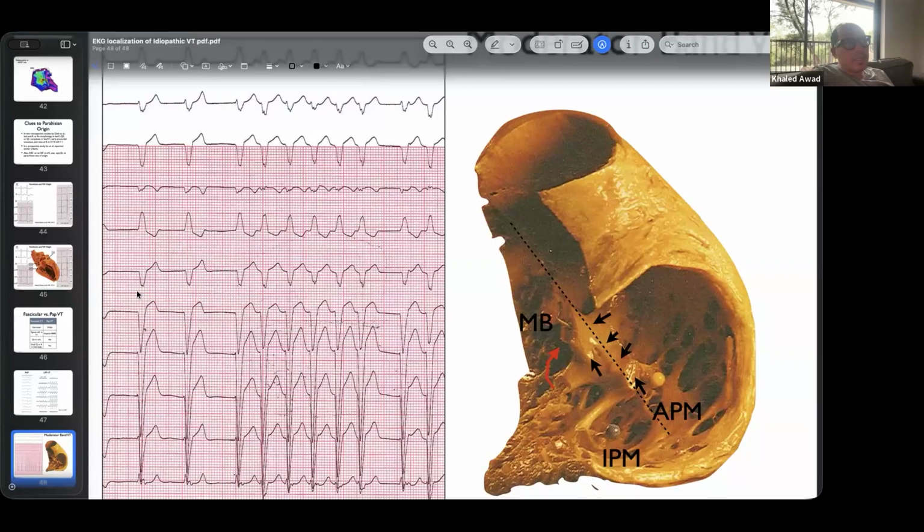angle a little bit. It is actually extremely easy to navigate the coronary sinus with an ablation catheter. Extremely easy. You have to have contact force, and I do it without fluoroscopy at all. Not at all. Just use the mapping system and the contact force and your understanding and sort of prediction of the shape of the coronary sinus.